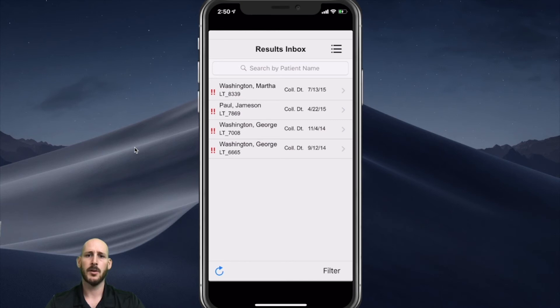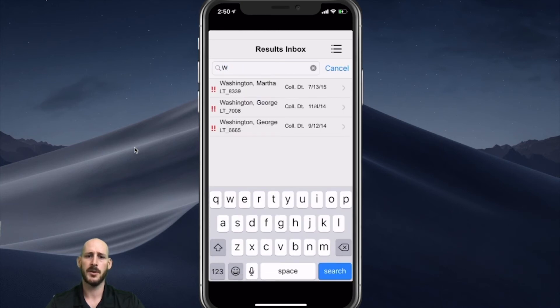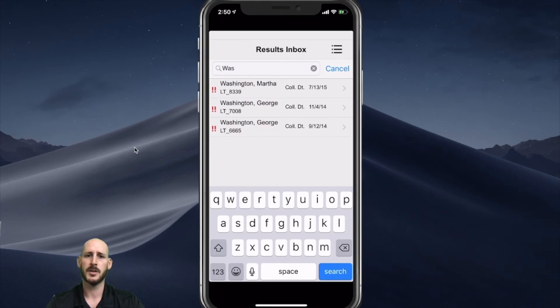I can also search for a patient in the inbox as well. I can type in just a few letters — in this case I'm typing in Washington — and I am viewing two results for George and one for Martha.